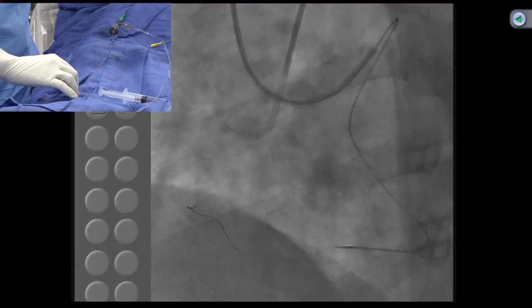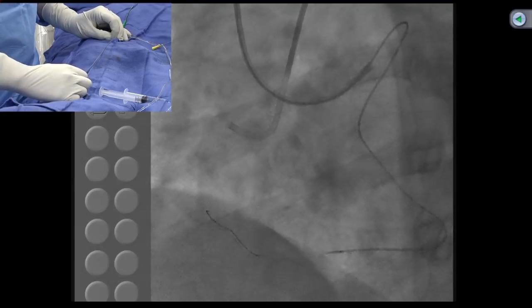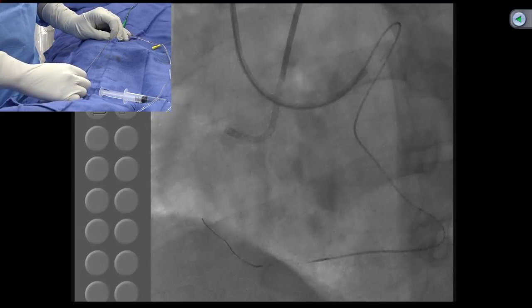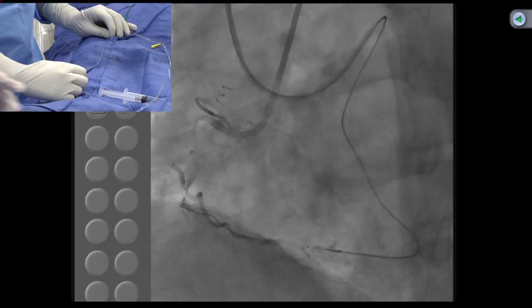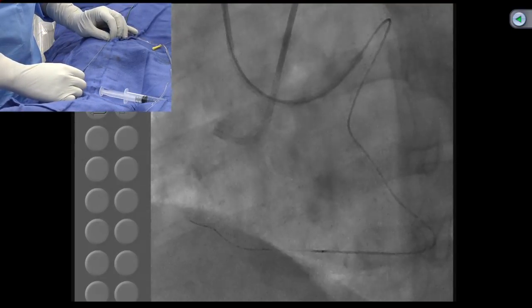Sir, take a deep breath. Completely eliminated the Tornus? Yeah. We actually do not carry Tornus in our cath lab, because we did not find any use beyond the Corsair. The reason is the Corsair with a torpedo-shaped pointed end is very, very useful in these cases.